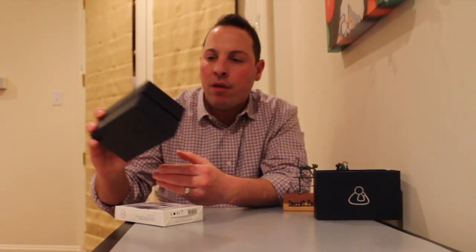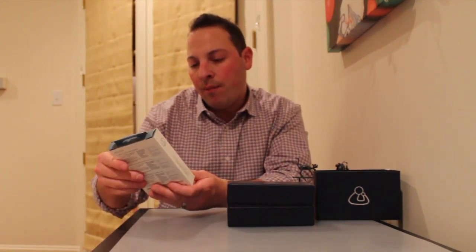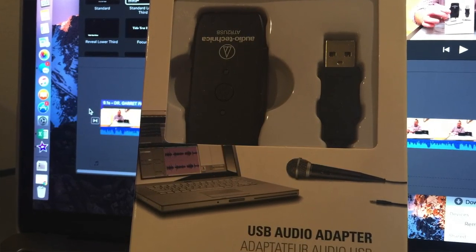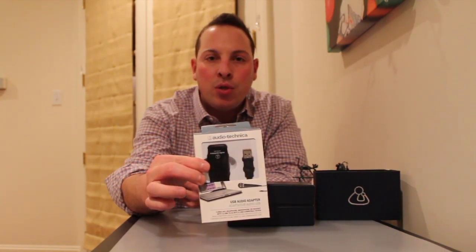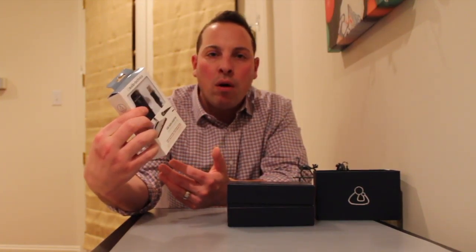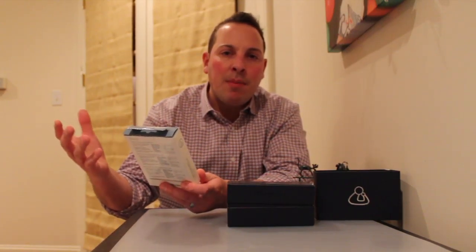Just got it in the mail today and wanted to do a little unboxing for the veterinary world out there. In the box, it comes with a USB audio adapter. The nice thing about a digital stethoscope is that it can be hooked up to some type of technology, whether it's a computer or mobile device like an iPhone through an app or some type of interface.